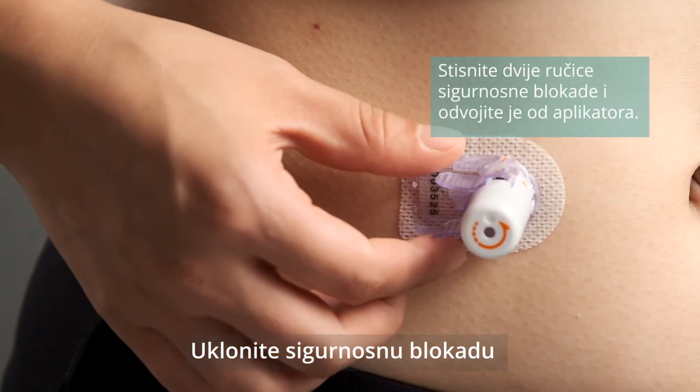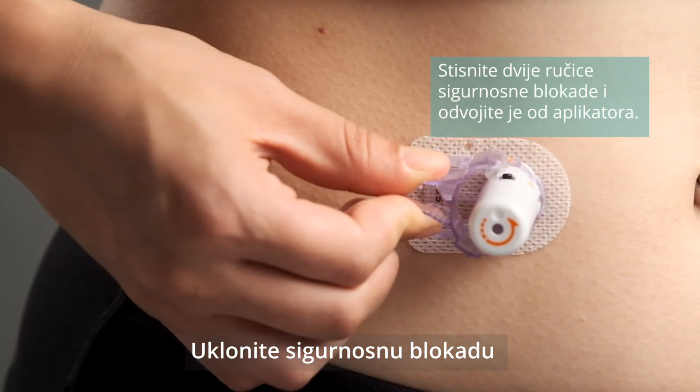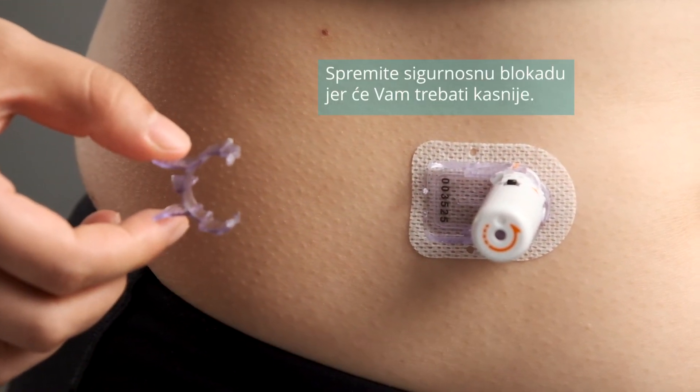Squeeze the two release tabs of the safety lock and remove it from the inserter. Save the safety lock — you will need it later.